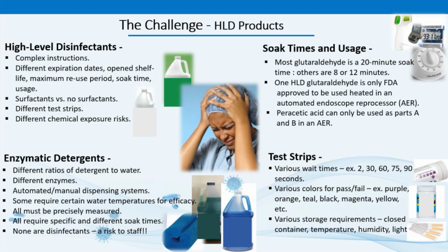Are they really accurate, and are we checking that accuracy? Some require certain water temperatures for efficacy. All must be precisely measured. All require specific and different soak times. And none are disinfectants, so there's a risk to staff. What about soak times and usage? They also have multiple variables due to multiple chemistries and soaking requirements.